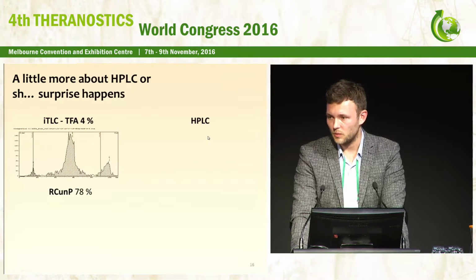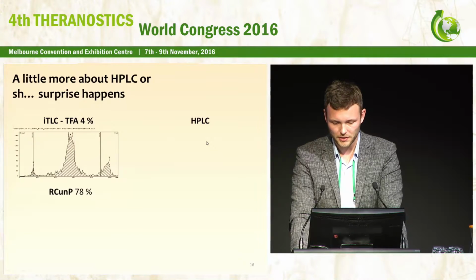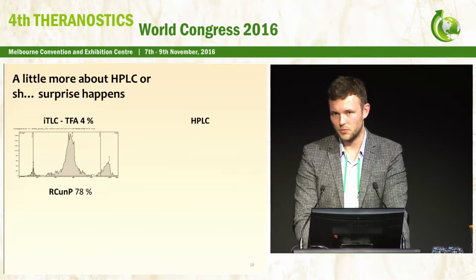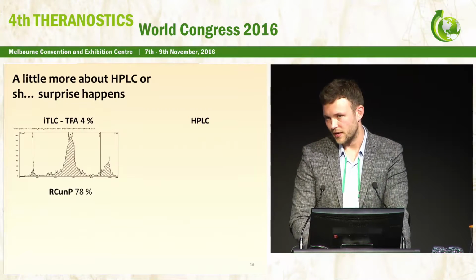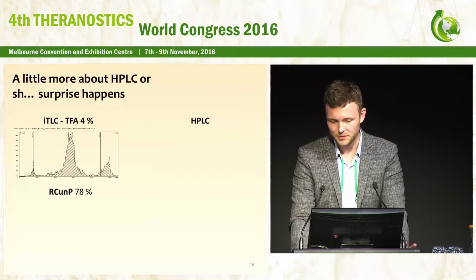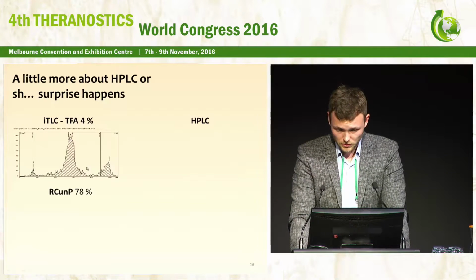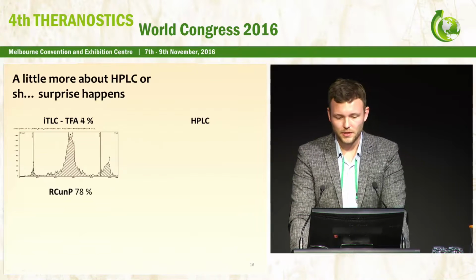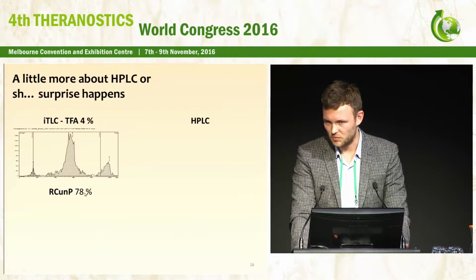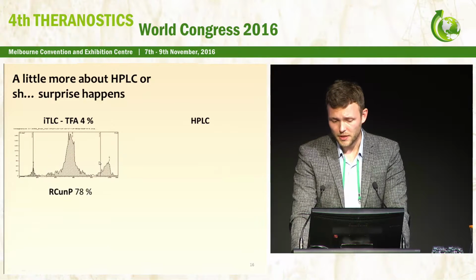And the last thing that I want to tell you is maybe scary, maybe strange. In the cross-validation work, we tried to take some different samples with different amounts of free gallium and the colloidal form, much higher than can be seen normally in routine practice. For example, this solution was tested with our method and other TLC methods, and the radiochemical impurity, of course, 78%, it's not purity, it's impurity, with a big amount of free gallium.